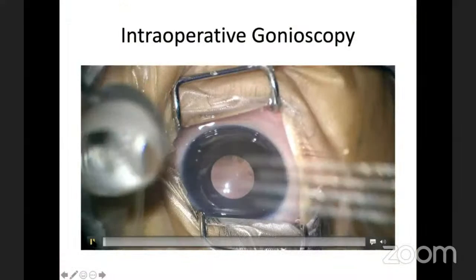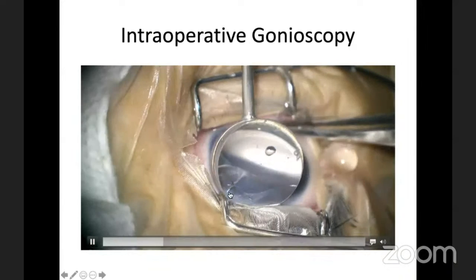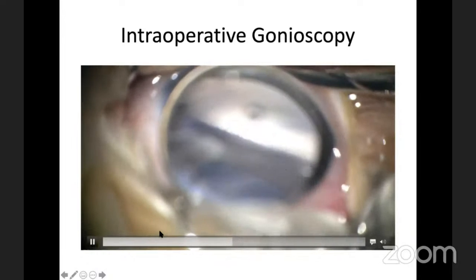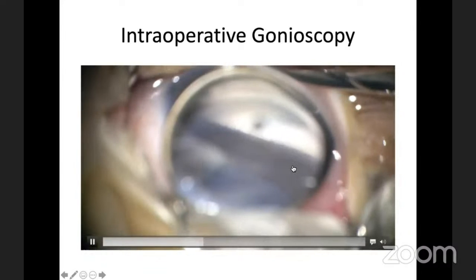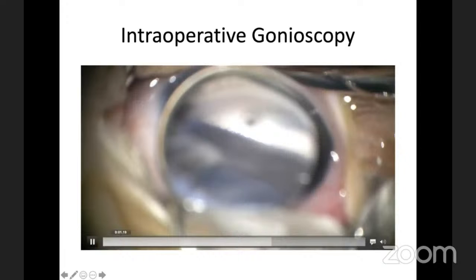And the second type of gonioscopy is the Swan-Jacob. Now this is a child of congenital glaucoma, and here you have no angle structure visible because there is an anterior insertion of the iris. So this is the Swan-Jacob gonioscopy being done before we start operating on a patient of congenital glaucoma.